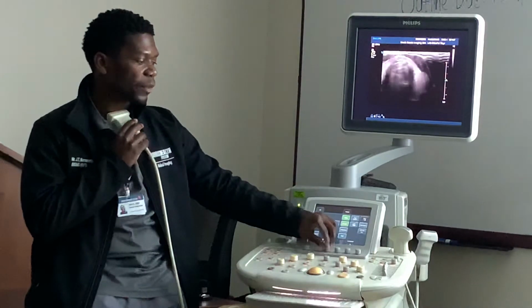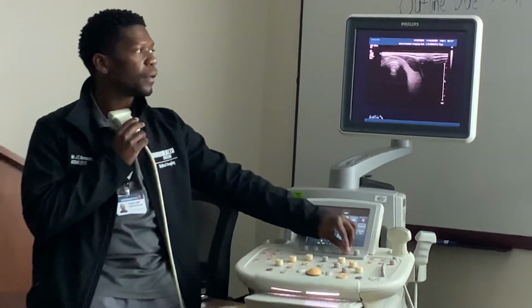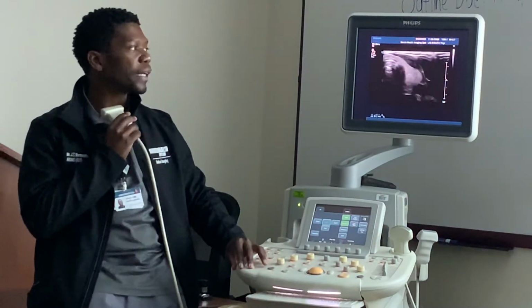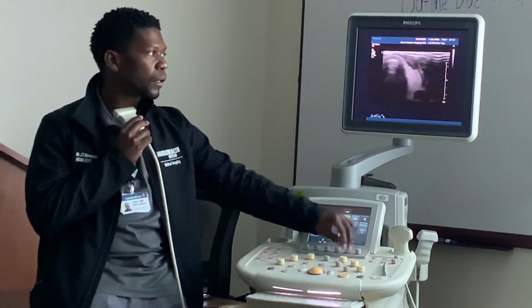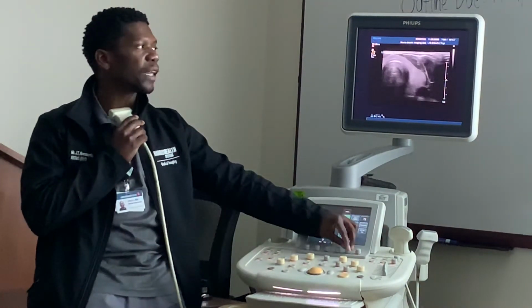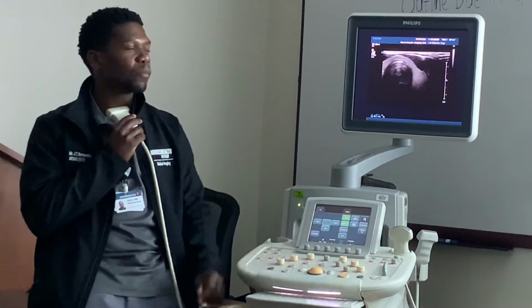Also, I'm going to adjust the other compression right here. Now I have a really black and white image, right? My compression is down to 47. I think that's the min. Yeah, 46 is the minimum right there. I think it goes to 100 or 78. Now I have more gray. You guys see that? I have more gray right there. When I bring my dynamic range down, now it's more black and white.